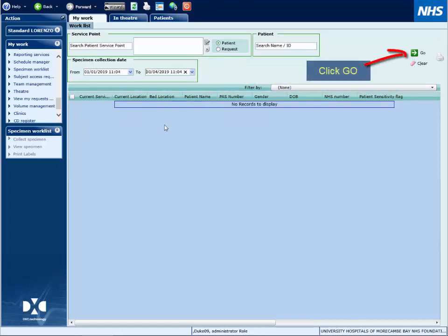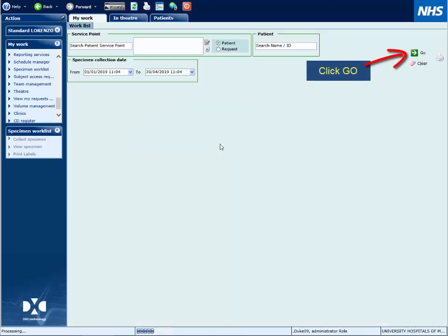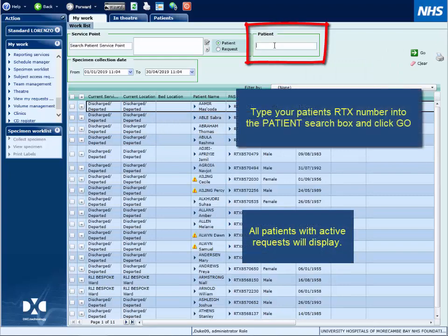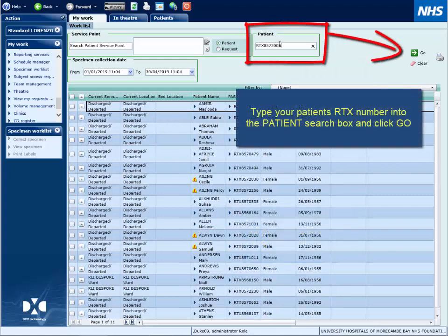Click Go and all the patients with requests will display. To narrow the search down, you can type the RTX number of your patient into the patient search box and click the Go button.